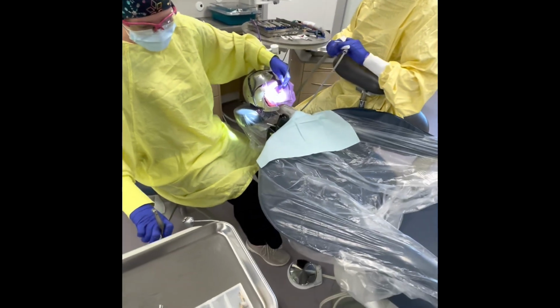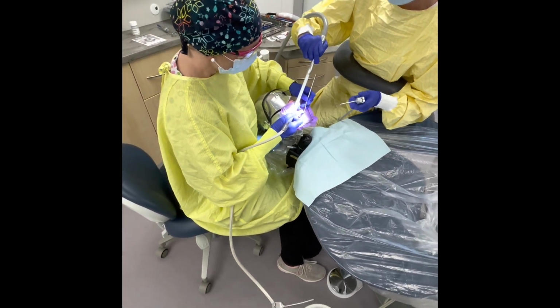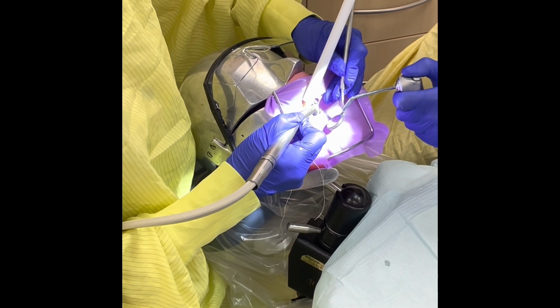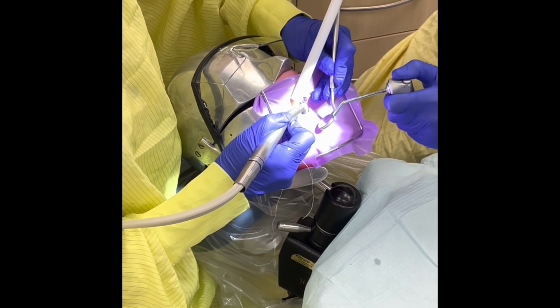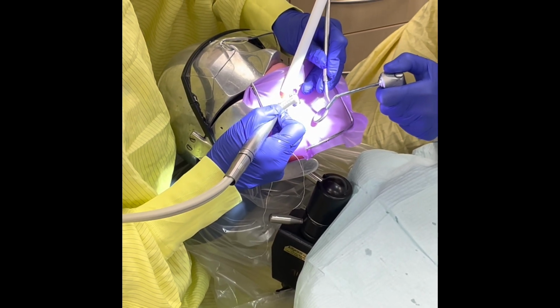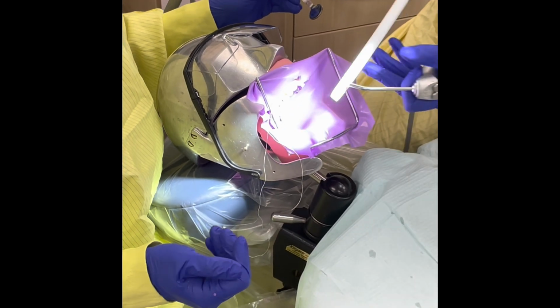So your operator will start with the high-speed hand piece, okay? So with the high speed, we're going to start on the anterior preparation. You will place your suction, and your operator will proceed to prep your preparation. Now, the important part here is that you are using air on your operator's mirror to make sure it is clear, and that you are not blocking their view with your air water syringe tip. Okay? All right, so you'll rinse and dry the preparation whenever your operator removes the hand pieces.